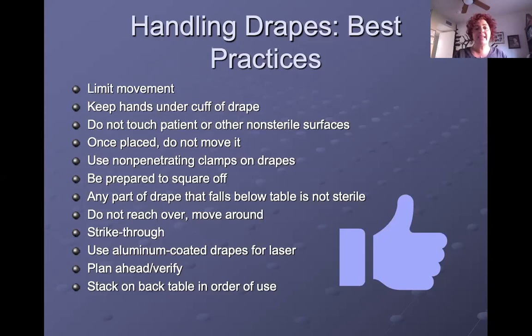Right? Once we place the drape, we can't move it. All right, a lot of times what happens is you place it and then you go to drape down towards the feet, let's say for laparotomy, and the fenestration shifts down like this. That's it, we're done. It's trash. Okay, so once it's placed, we can't move it around at all. Have to make sure that it stays there. That's why I usually put one hand on or near the fenestration as I'm draping one way and then the other, just to help it from shifting. And I'll show you how to do that.